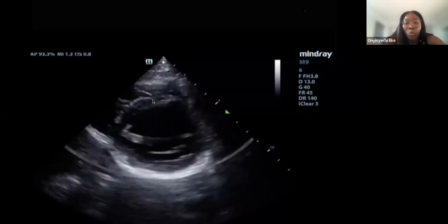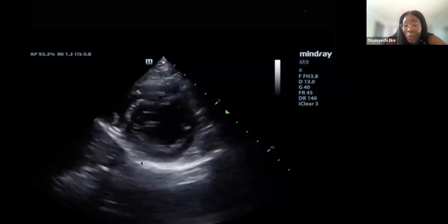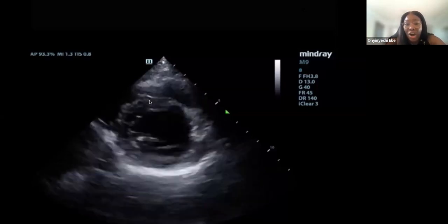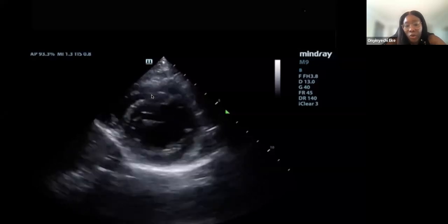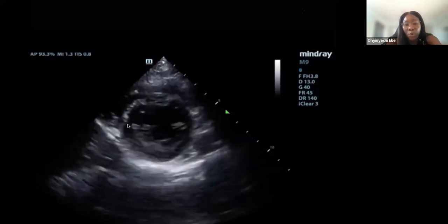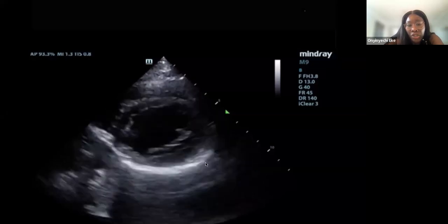This is a good view that the cardiologists use when they are trying to look for any regional wall motion abnormalities, and we do that in the ED as well. Again, it's a good view to look at ejection fraction when there's any type of right heart strain, whether it is acute or chronic. The septum here is going to bow out. So if there's any sign of right heart strain, this will not look like a circle. This will actually look flat. We will discuss that more. Then we also have the pericardium here that is bright, right? So if there's any fluid around the heart, we will appreciate it here.